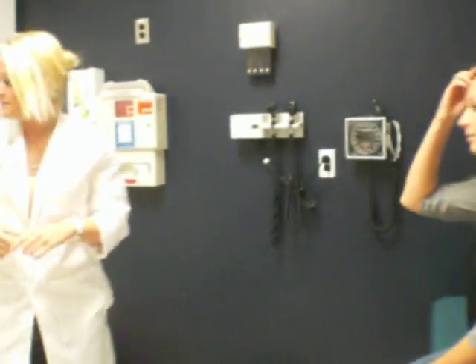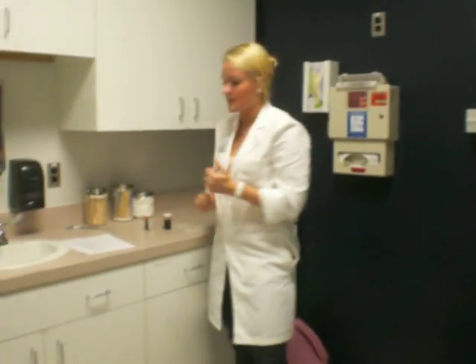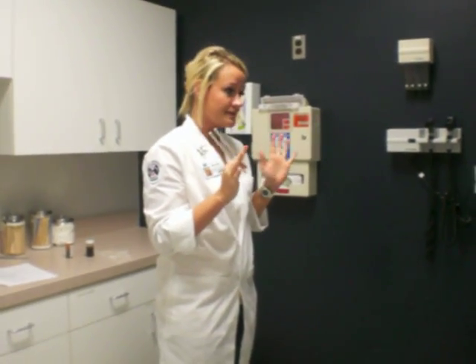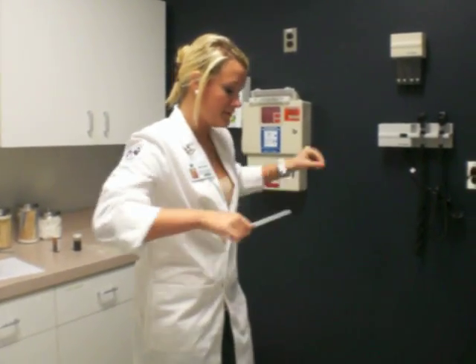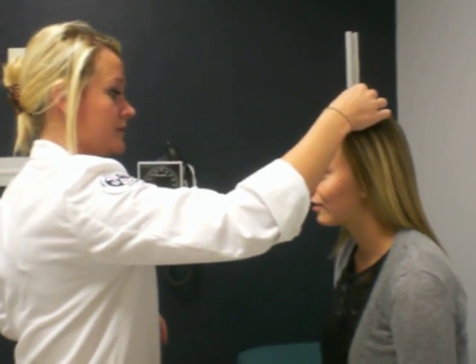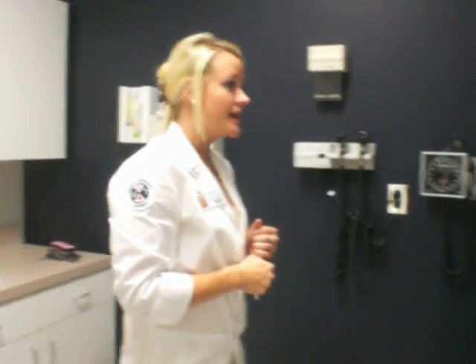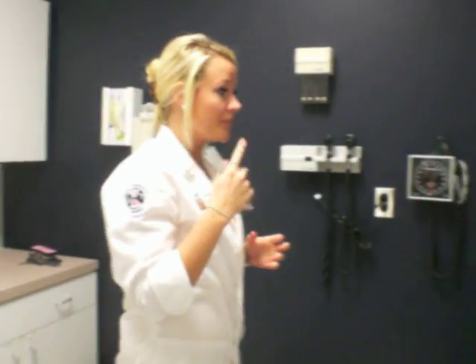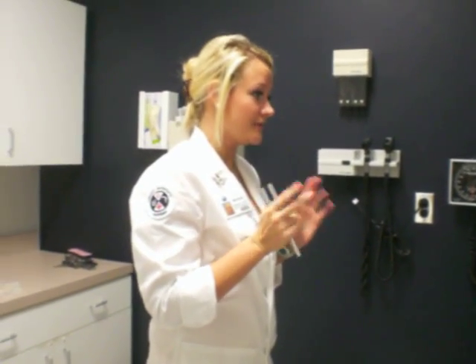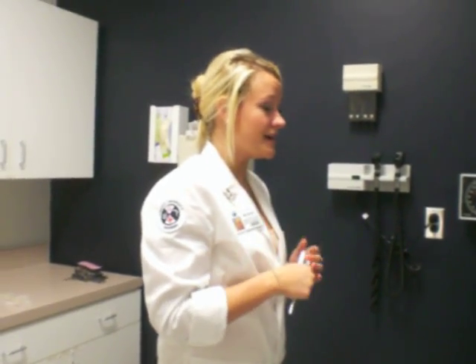Alright, so next we are going to do a hearing test. I'm just going to put this at the top of your head, and then you let me know if you can hear it equally in both sides of your ears, alright? Equally in both? Mm-hmm. Alright, if you could hear it more, let's say in your left side, I would have you plug the left side of your ear up. We would do it again and see if you can still hear it, if you hear it more in that left side or not. And if you did, then that would be normal.